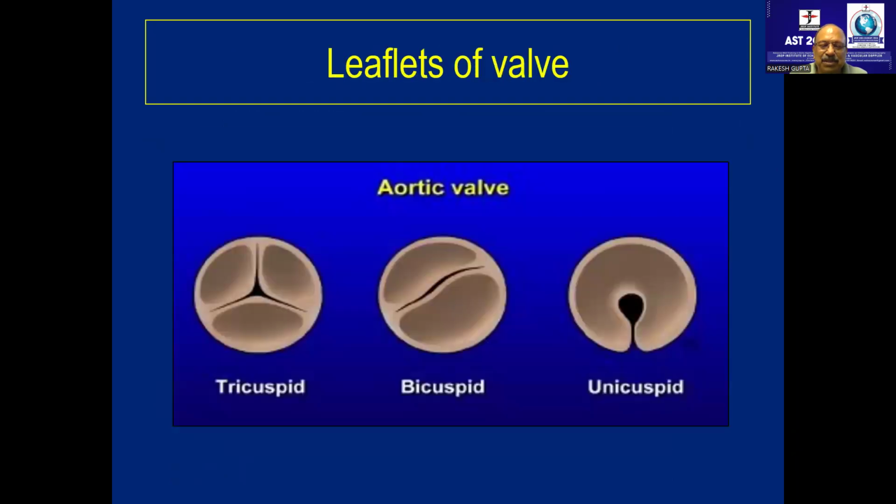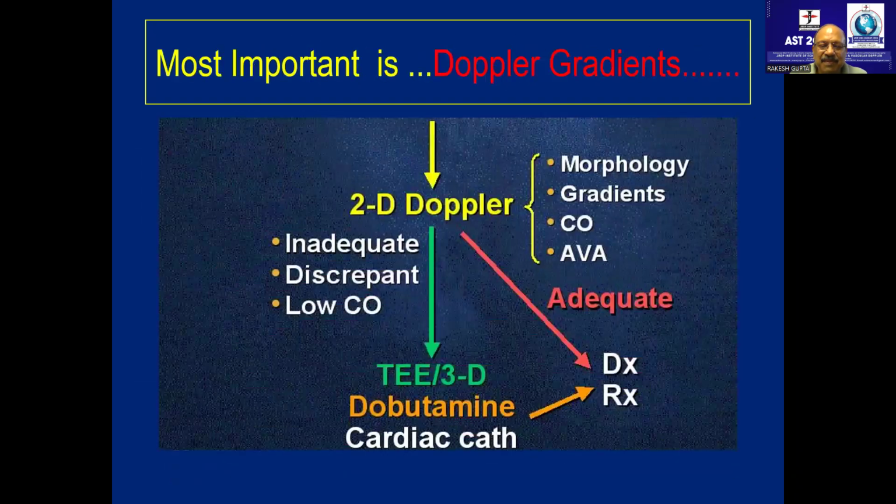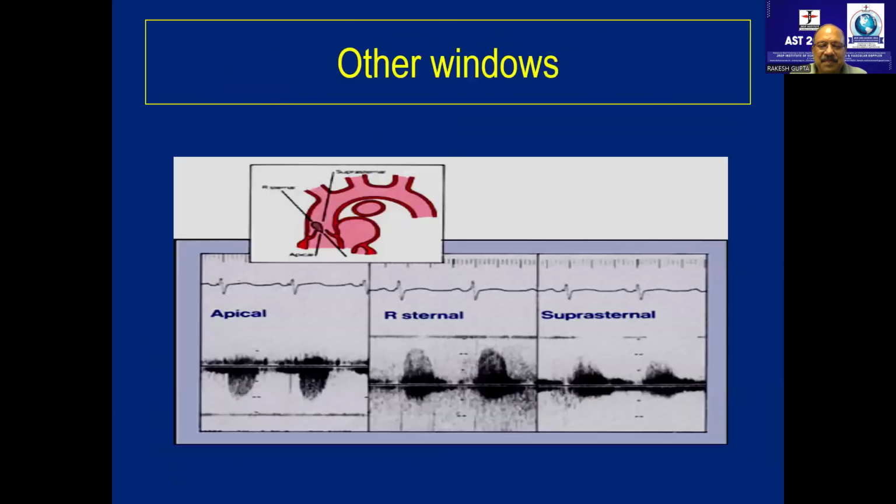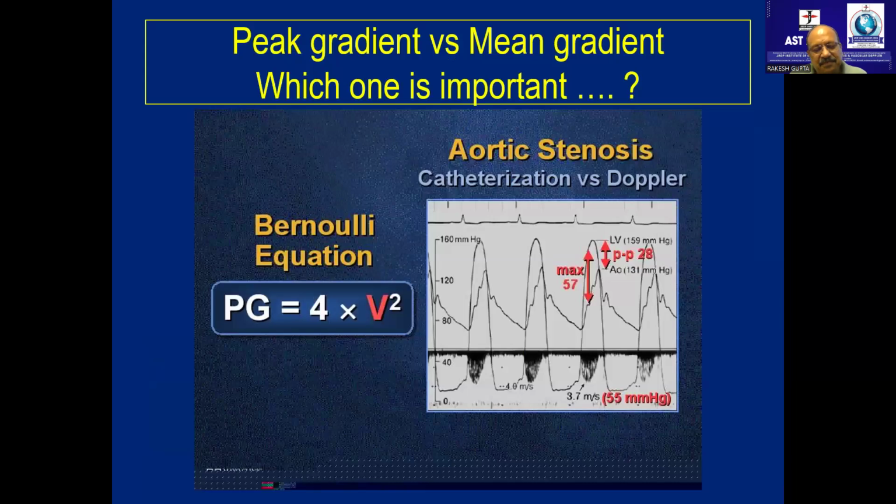Give me a second, let me go to some 4-chamber view. Sir, whenever there is associated AR, will the same criteria be applied for the severity grading of aortic stenosis? Yes, AR, same criteria. AS with MR will be a difficult problem, because AS with MR will really be a tricky job, you know.